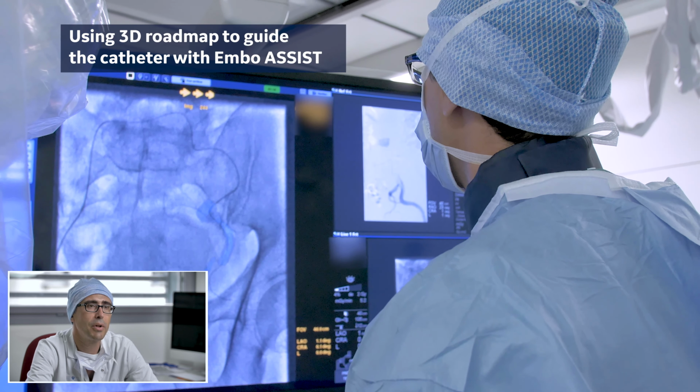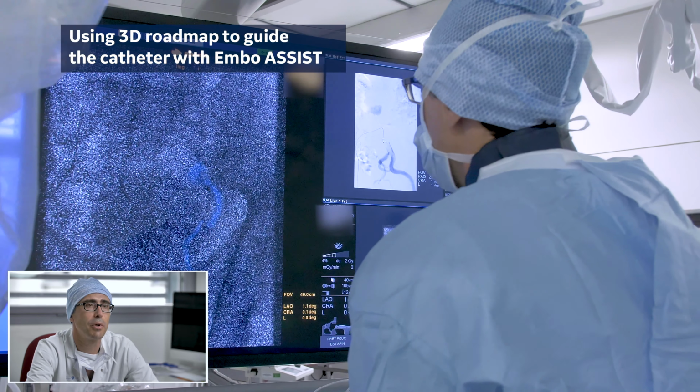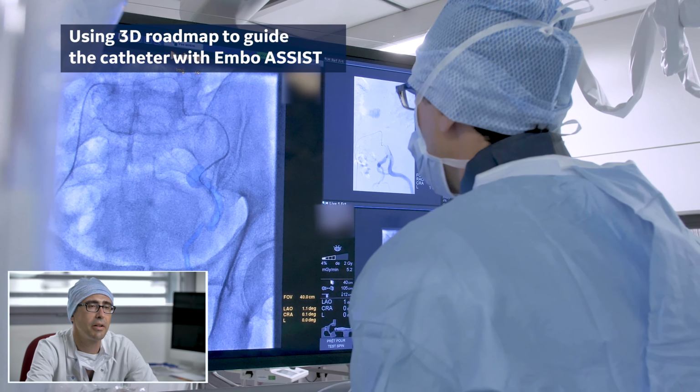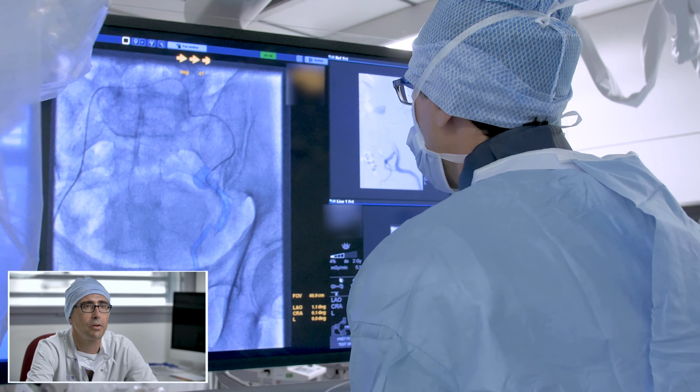And then we are performing the embolisation and using the same cone beam CT we are trying to identify the anastomosis and the contrast uptake after the procedure.